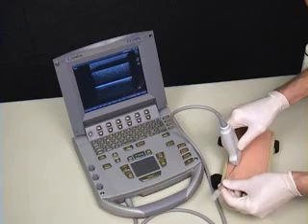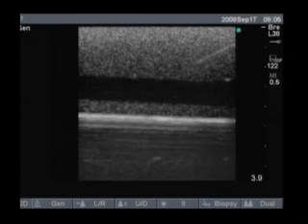Simulab's multifunctional venipuncture pads can be used to practice ultrasound-guided catheter insertion, injections, or drawing blood.